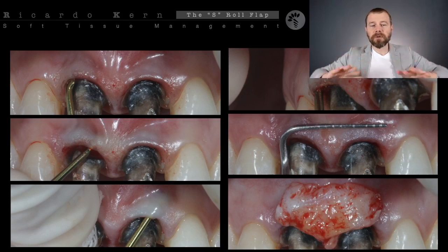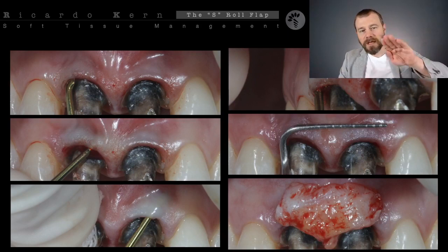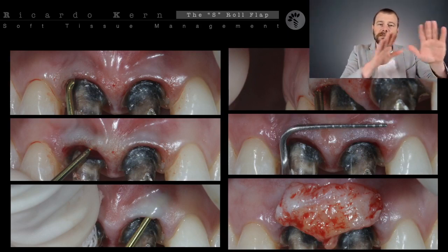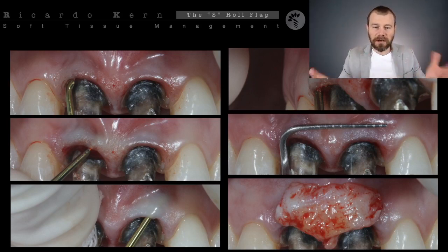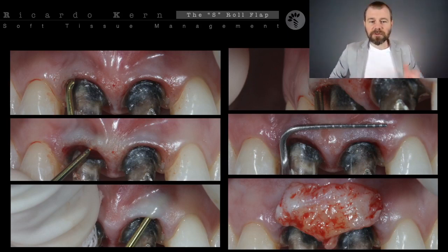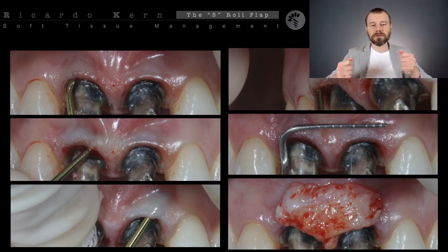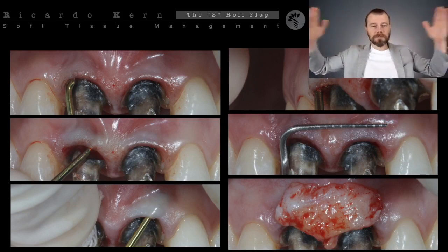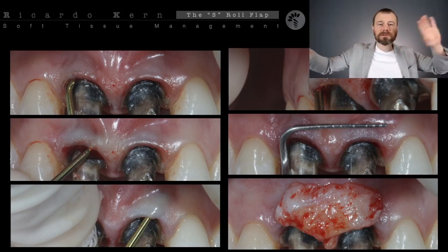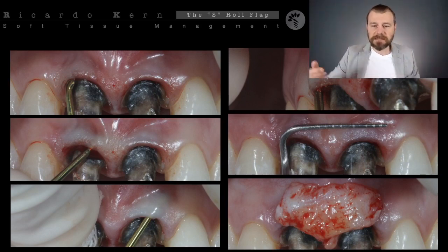And usually this preparation is a full thickness flap all over, okay? So everything you need to do is detach the tissue from the bone, full thickness flap with a tunneling instrument. As you're not going to advance this tissue a lot, you do not need to bring this tunneling far away from the lateral incisors and not apically, a little larger than the size of your connective tissue graft, okay?